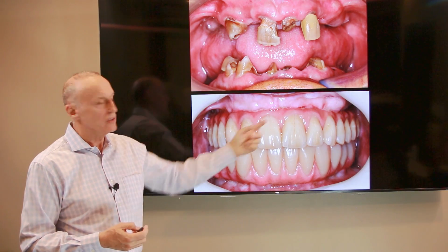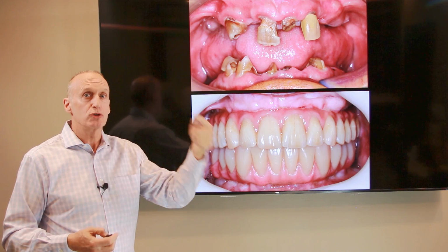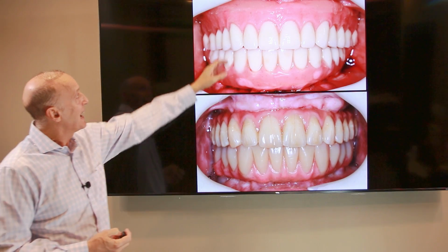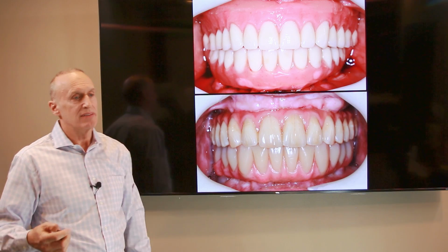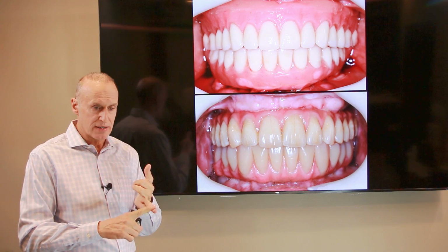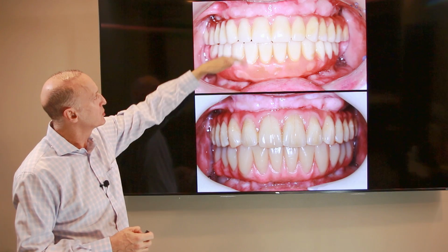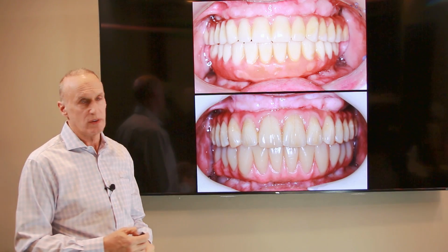And in those cases, you'll have some pink. It's not a deal breaker, but it's an emotional deal breaker for some people. That's why I wanted to go through this and talk about it. So he had to wear this temporary denture for 2.5 months because he didn't have enough good teeth and he didn't have enough bone density to give him a fixed temporary. So when we went to convert his denture to his temporary, this is what we ended up with, and this is how it translates into the final restoration.